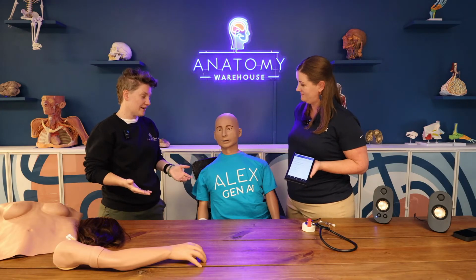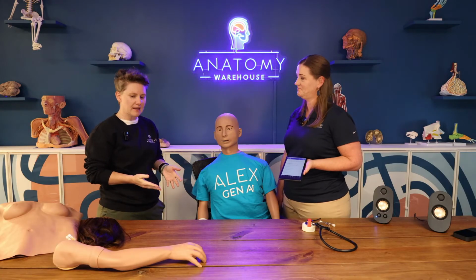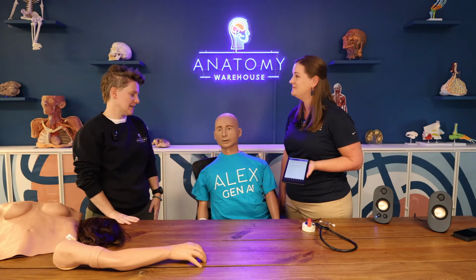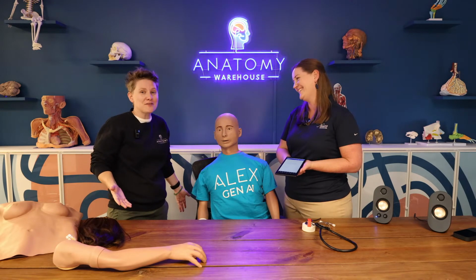I mean, you get so much out of this mannequin right out of the box, like you said. You said it ships at 67 pounds. We ship it for free. So this thing could be 100 pounds.